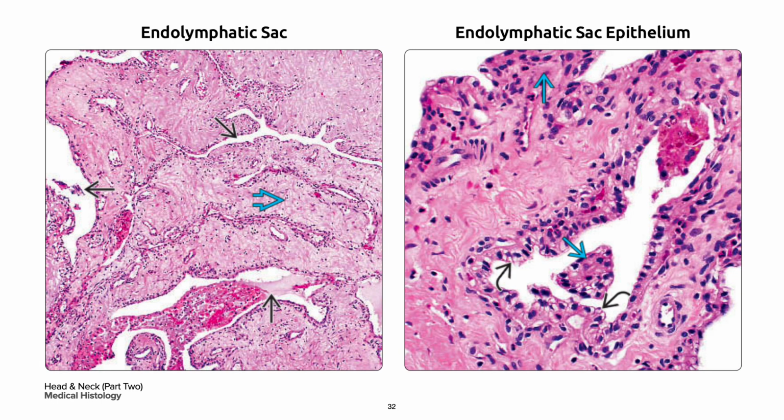On your left, while not typically seen as a surgical specimen, a portion of the endolymphatic sac can be seen in tumor resection specimens. These appear as epithelial-lined cystic spaces in a single black arrow embedded within your loose connective tissue in bold blue arrow or your bone.